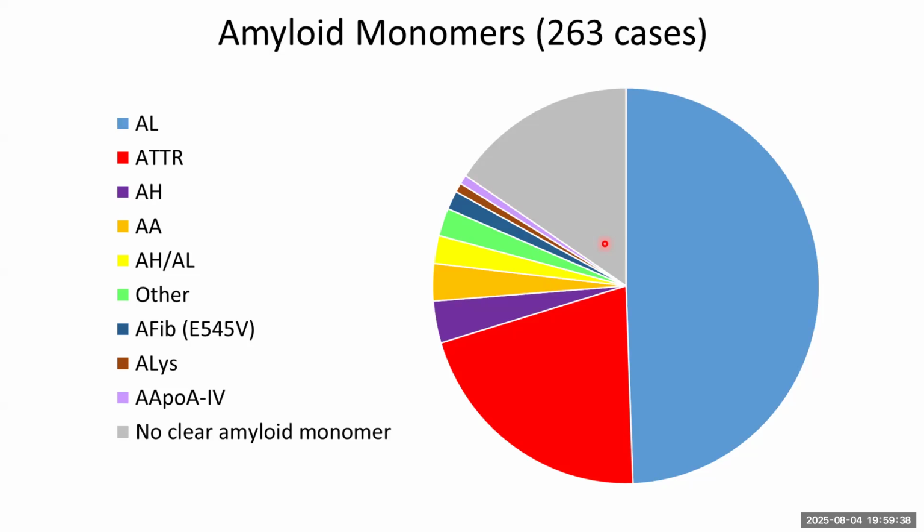But there's always challenges. We have had cases where we've questioned whether the Congo red staining was convincing, and upon reflection, the team have said, yeah, we actually overcalled it. We're not in control of those variables, but we do our best to get a result as often as we can and as convincing a case as we can present.